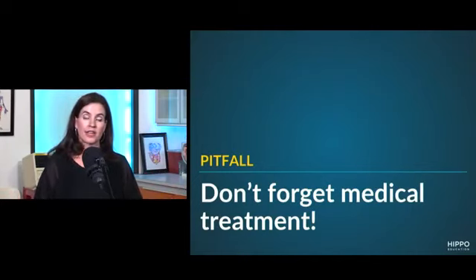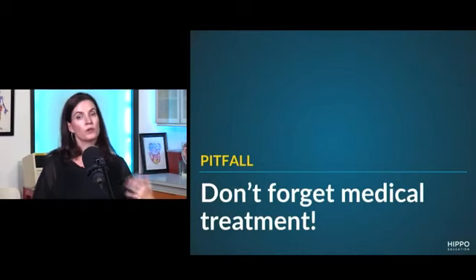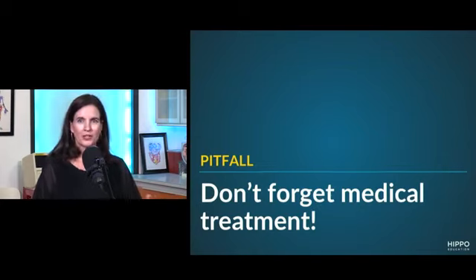Because the ventilator doesn't actually fix anybody's medical problem. It just buys you time and oxygenation while your other therapy kicks in. So if this is a pneumonia patient, don't walk away from this patient until you've given them appropriate resuscitation, antibiotics, the therapy they need. If this is CHF, same.